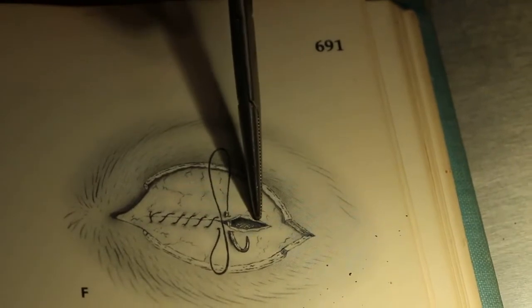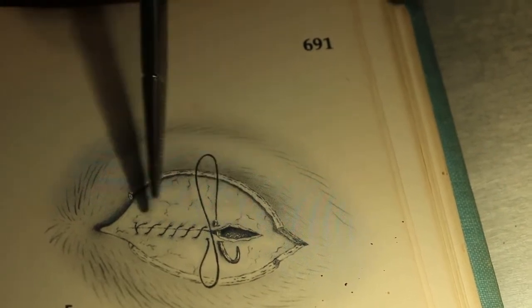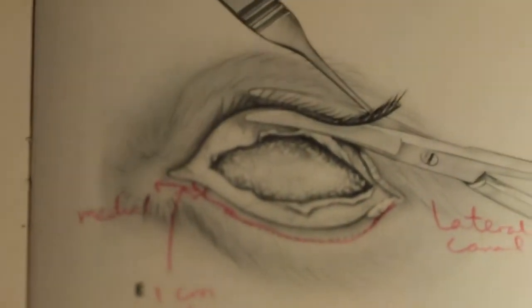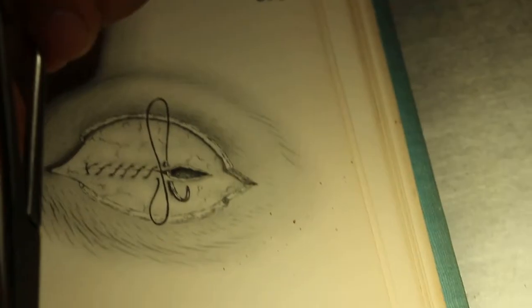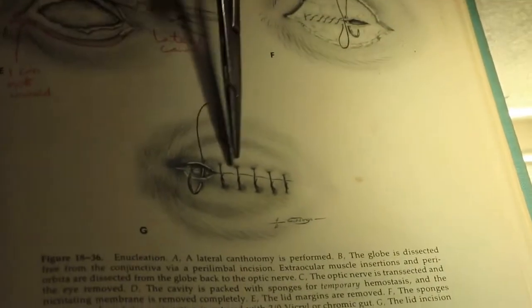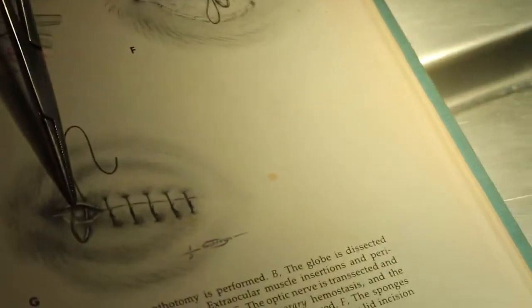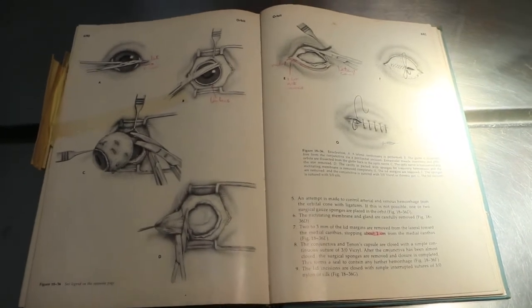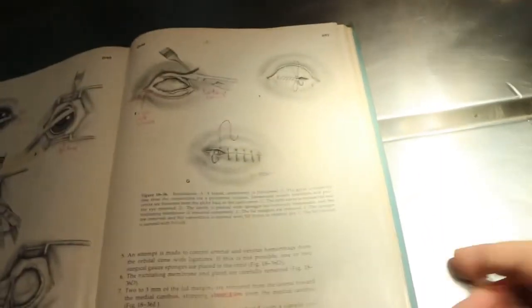Then the next step will be to suture the lid margins, which have been removed already. The lid margins have been removed, but you can see from here by cutting it off. So I suture the inside first, inside the conjunctiva, and after that, finally, I suture the eyelid margins actually, and this is the result. So I summarize it first. I just show the whole thing for any veterinary student interested in this surgery.